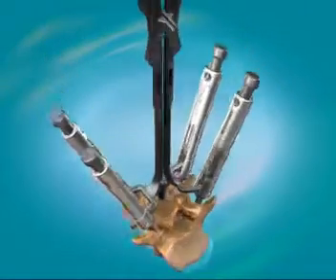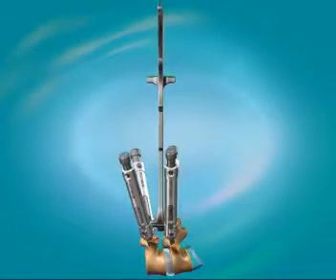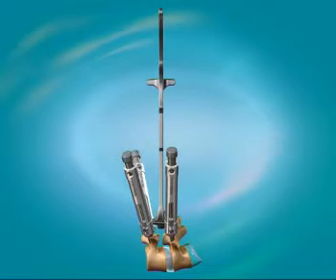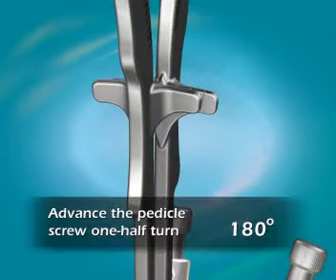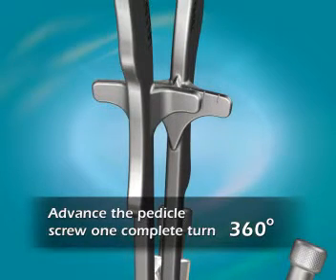The 2 halves of the gauge will be aligned so that they become parallel from a side view when all 4 pedicle screws are seated to the appropriate depth. Markings on the gauge indicate the amount of depth adjustment that is needed to be made to one or more of the pedicle screws. A short line indicates the need to make a 1/2 turn, 180-degree adjustment, while a long line indicates the need to make a complete turn, 360-degree adjustment.